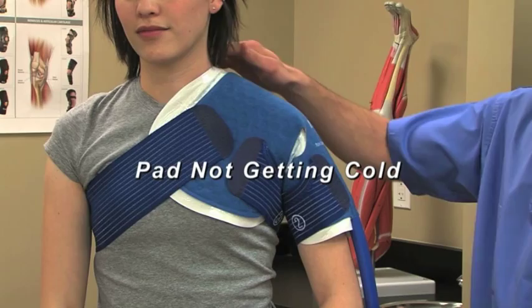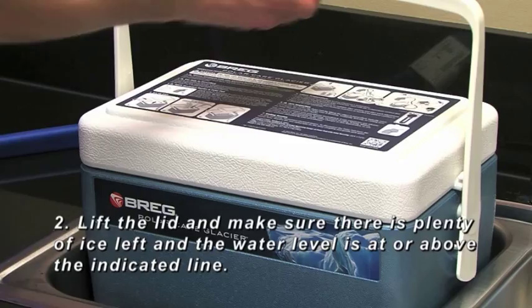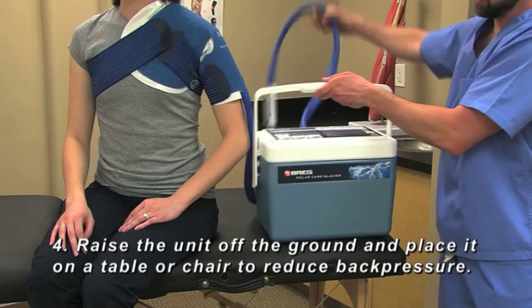One: make sure the power outlet is working and the plug is fully engaged with the unit. Two: lift the lid and make sure there's plenty of ice left and the water level is at or above the indicated line. Three: replace the lid and ensure there are no kinks in the blue insulation hose. Four: raise the unit off the ground and place it on a table or chair to reduce back pressure.